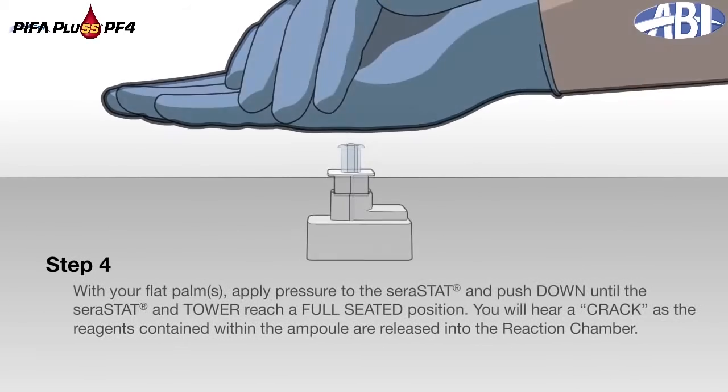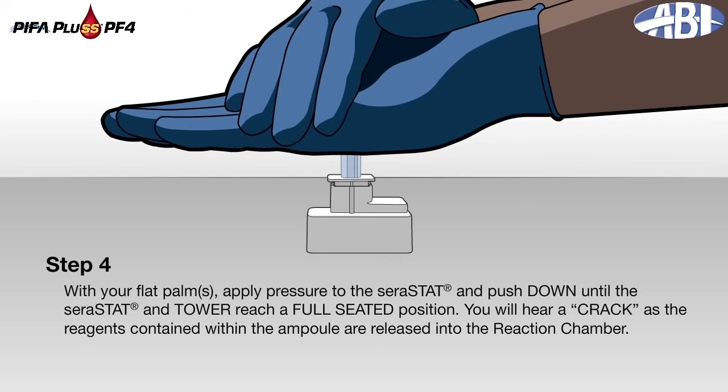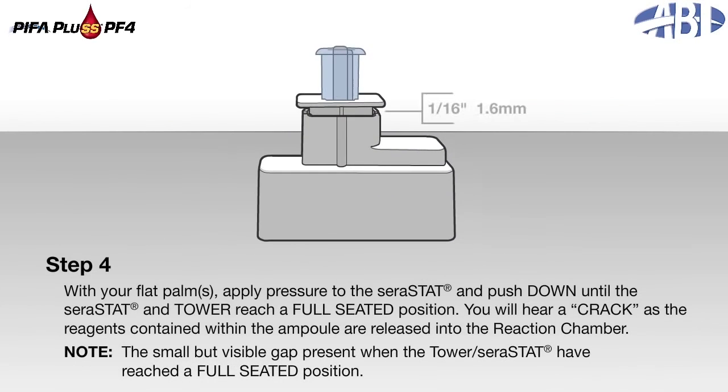Step 4: With your flat palms, apply pressure to the serastat and push down until the serastat and tower reach a full seated position. You will hear a crack as the reagents contained within the ampoule are released into the reaction chamber. Note the small but visible gap present when the serastat has reached a full seated position in the tower.